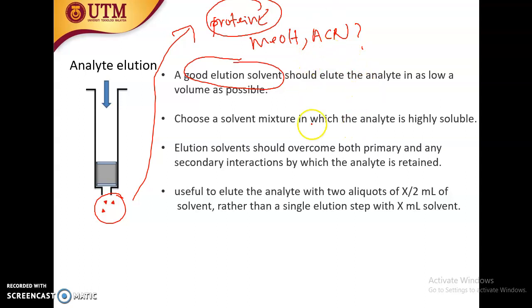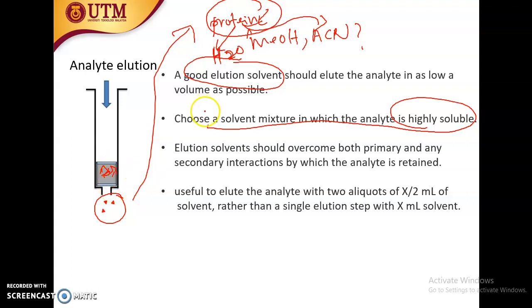Okay, choose a solvent, a mixture, in which the analyte is highly soluble. It means that if protein loves acetonitrile, you use acetonitrile. Protein doesn't love water, so if it doesn't love water, it will not come out. Okay, water cannot break the bond between the analyte and the particles over here.